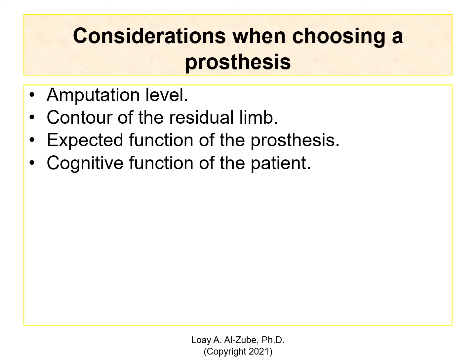And that affects the material and the design and everything. Cognitive function. How would you define a cognitive function of the subject? My understanding of it is that the level of education and the smoothness of them using technology, how easy for them to accept and use technology.